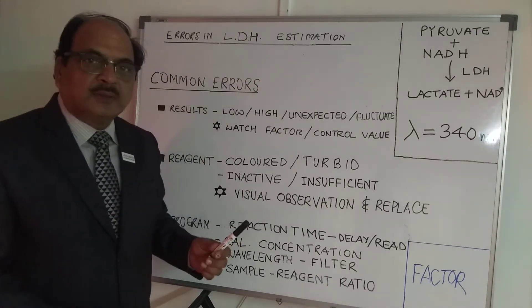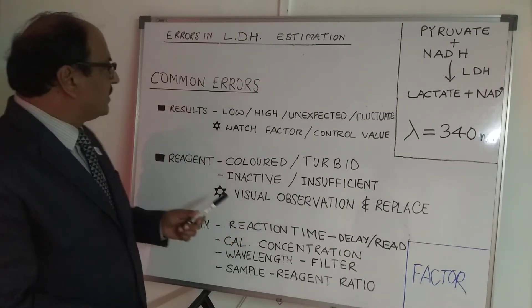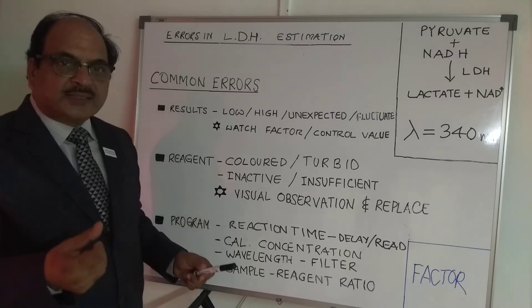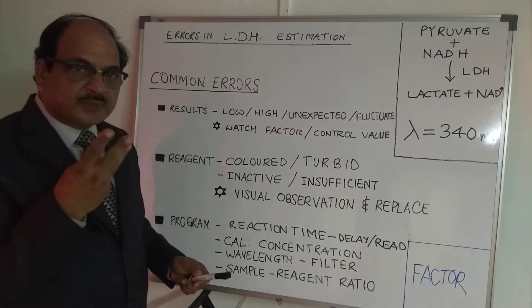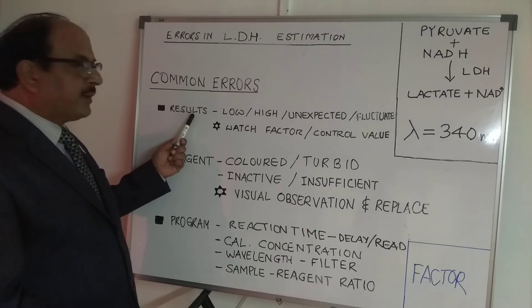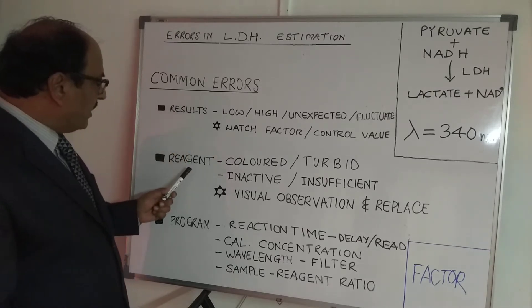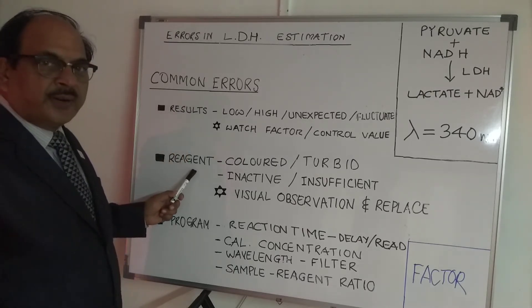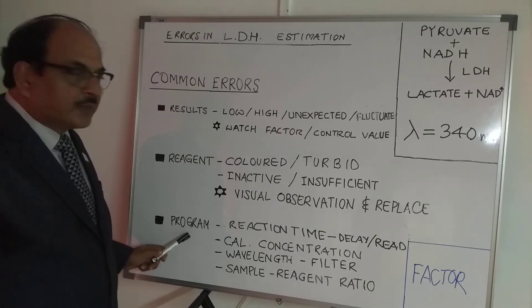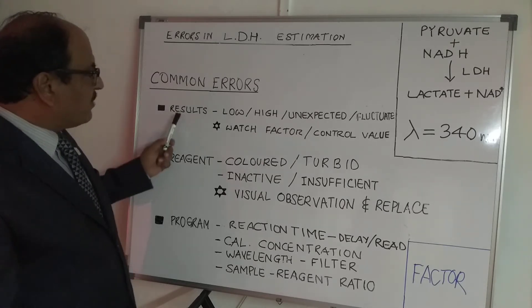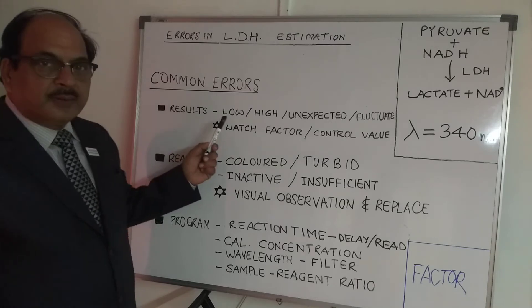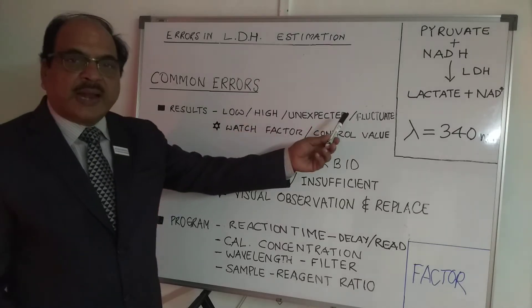Decrease in absorbance is the measure of LDH activity. Now, the common errors in LDH estimation are categorized into three types: Type 1 is result-oriented, Type 2 is reagent-oriented, and Type 3 is program-oriented.